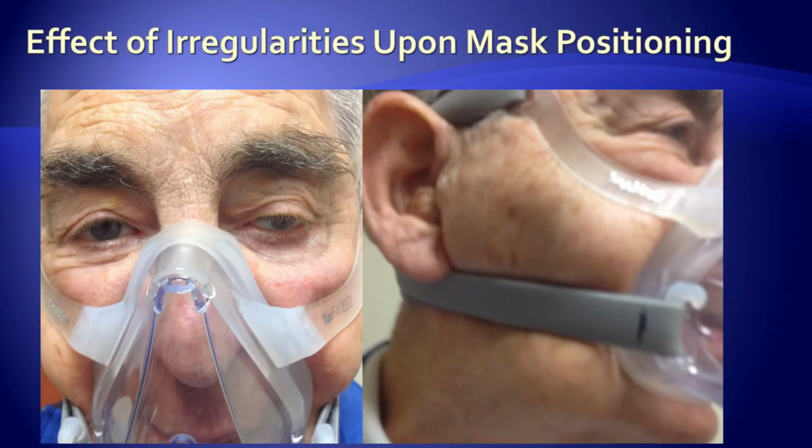So you've seen all of the facts of this case, but what would you, in your mind, think of doing that could remedy the situation or make the situation better? Of course, everyone's saying, well, let's try some different masks, but this patient has tried already 15 different masks and all came out with the same problem, that it was still leaking very badly and causing him a lot of pain.